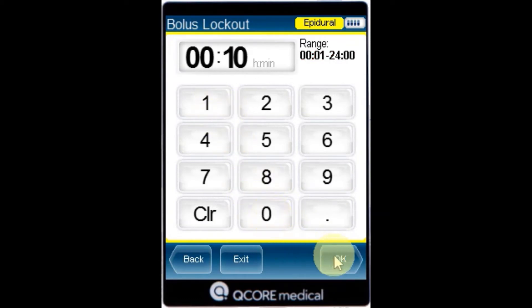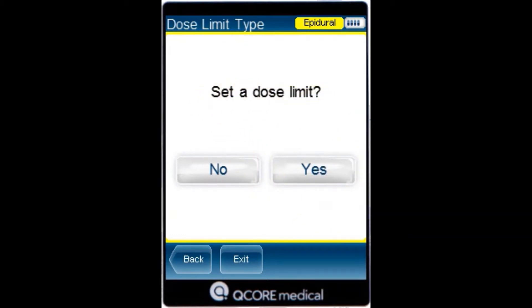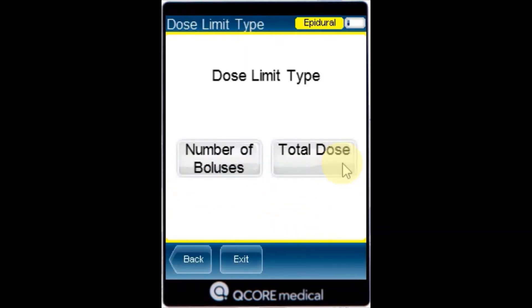From the dose limit type screen specify whether the infusion will have dose limits. Press yes to apply or no to program without dose limits. From the dose limit type screen select the appropriate dose limit type.